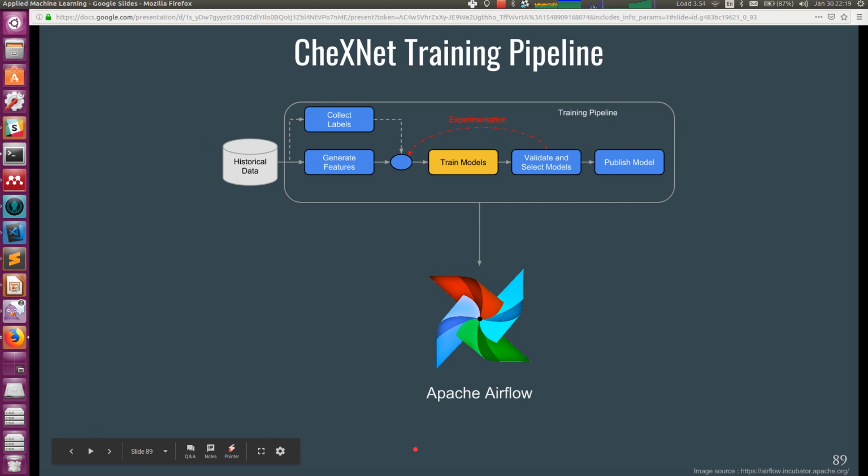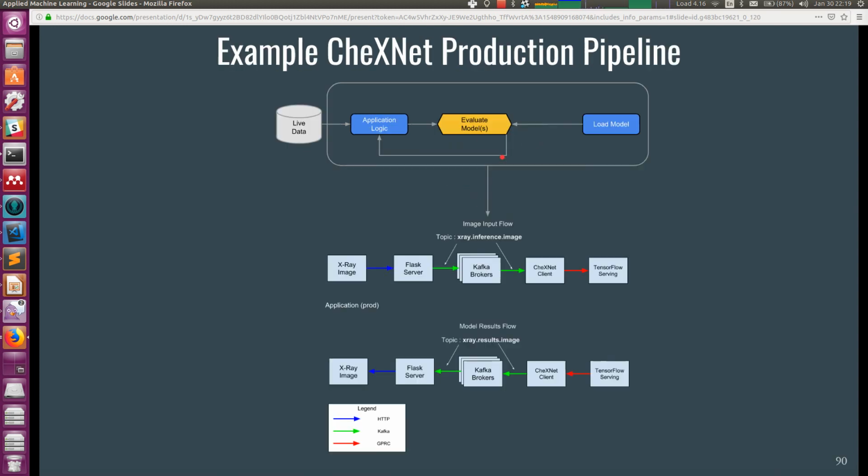The training pipeline will look something like this. We have this tool called Apache Airflow that allows us to define what are called directed acyclic graphs that can be used to describe workflows. In this example, we'll be using Airflow to describe the training workflow. Listed here, most of the boxes that are contained in this logical diagram are already defined in our tooling, and Airflow really just goes in and issues SSHs into a machine for us and issues the commands to make this particular process here, training our model, run.